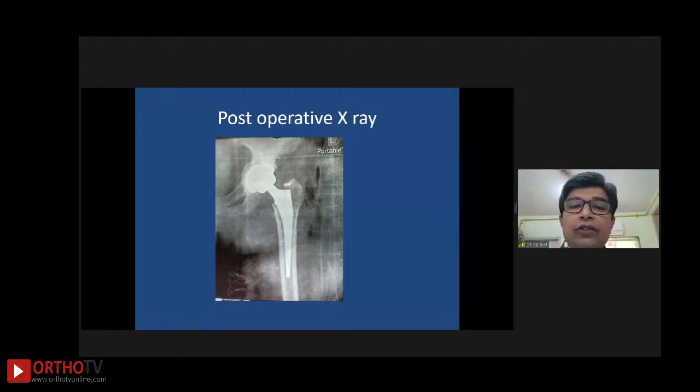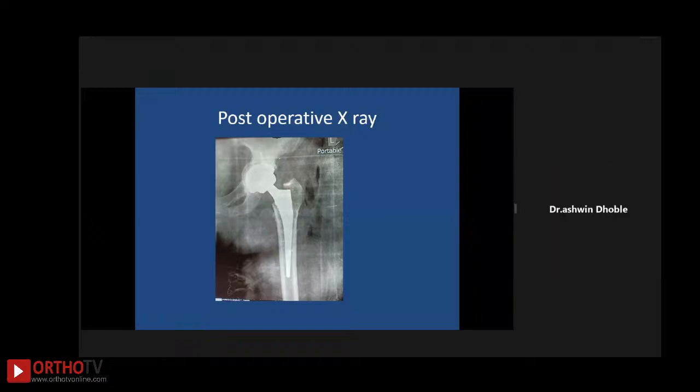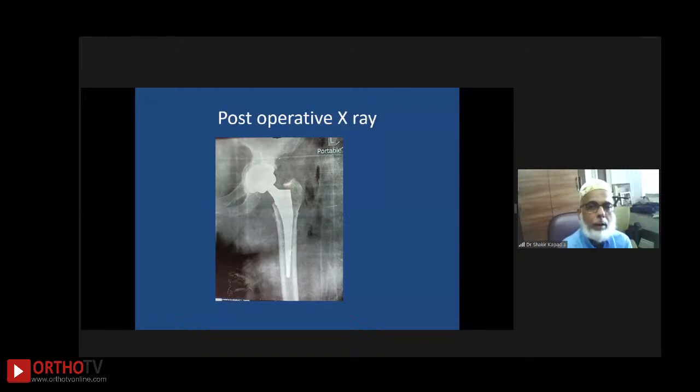And this is the picture. I think it is a nice thing. You have used something like a press fit principle without building up the floor of the hip. That also is acceptable because it's sitting quite nicely. And a press fit cup incorporation is a lot of time more better than when you put a bone graft and get your hip center down.